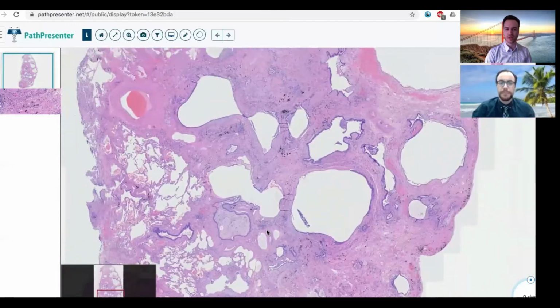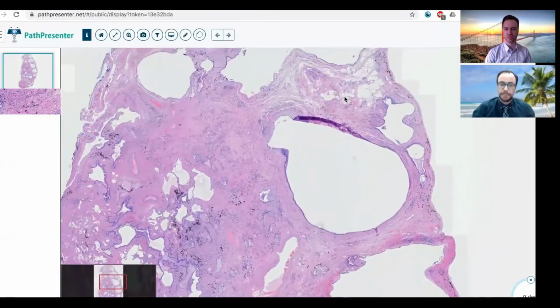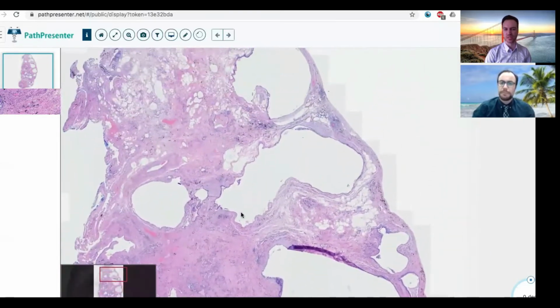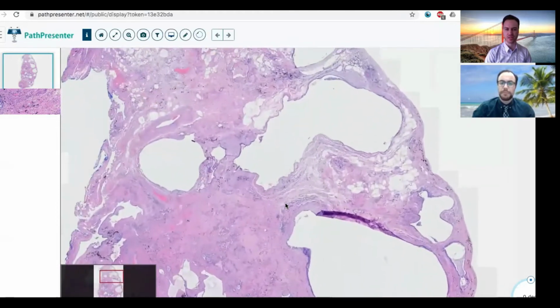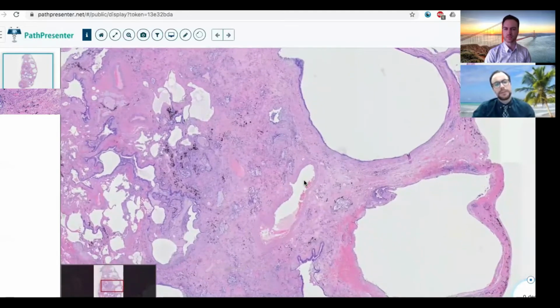I think so. From what I understand, the CHP was more airway centered. This one was more subpleural. Yeah. I also heard these can sometimes be a bit of an overlap, but this one looked a bit more classic UIP. Yeah. And how would an NSIP case look?